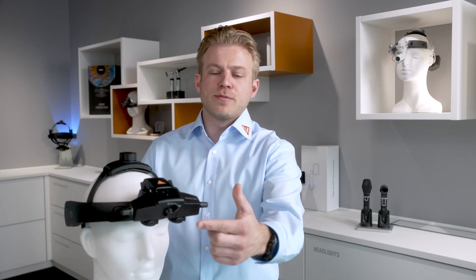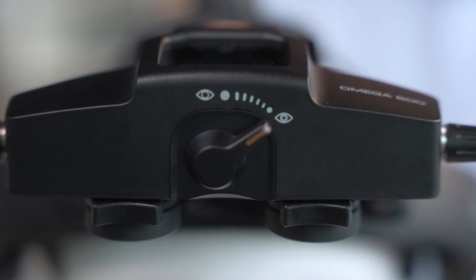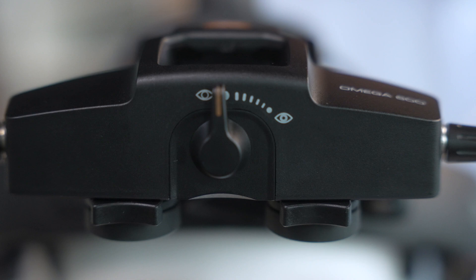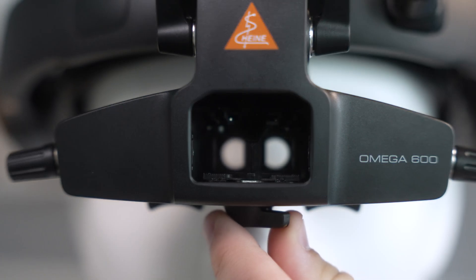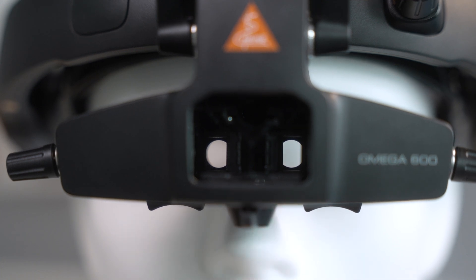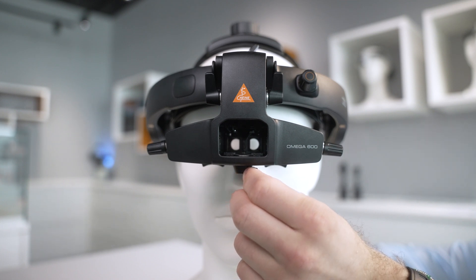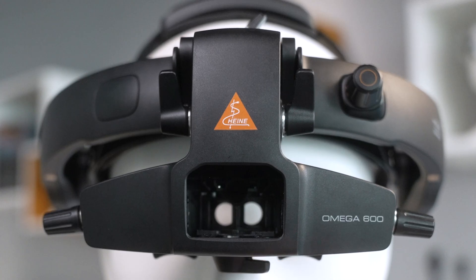Underneath the optical unit, there's a lever for stereoscopic adjustment, often referred to as the small pupil function. By moving the lever, you can adjust both the convergence, or the viewing angle, as well as the parallax, or the illumination angle, in sync and on a continuous scale. This helps get the clearest 3D image possible for different pupil sizes and different viewing angles. For most exams, especially with dilated pupils or model eyes, you'll want to set it to the widest position. This gives you the best 3D image with minimal reflections. If you're working with small pupils or need to examine the far periphery, you can rotate the dial to narrow the angle. Just keep in mind that this may slightly reduce stereo detail.